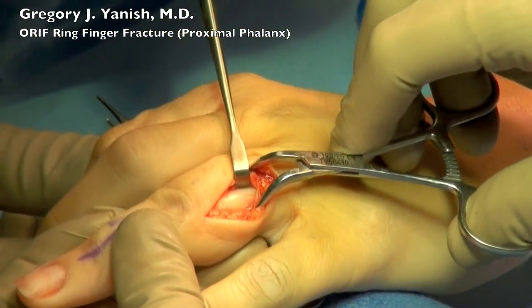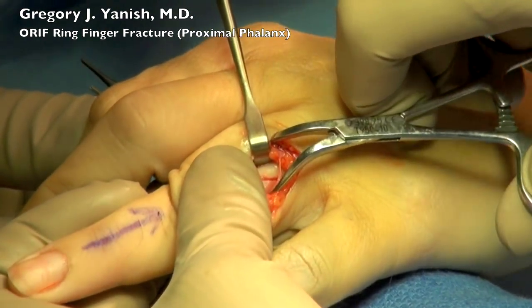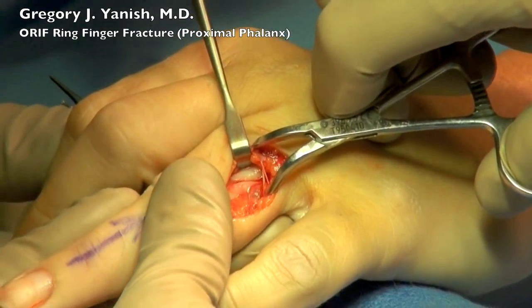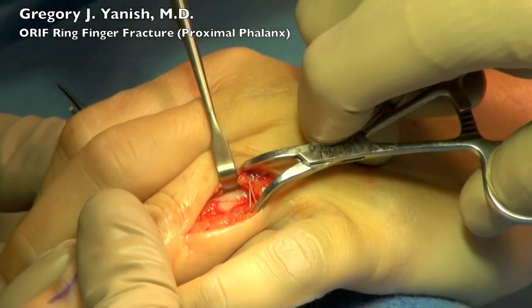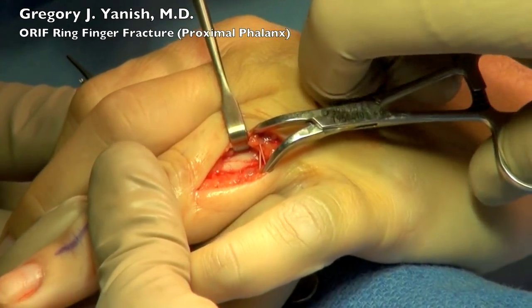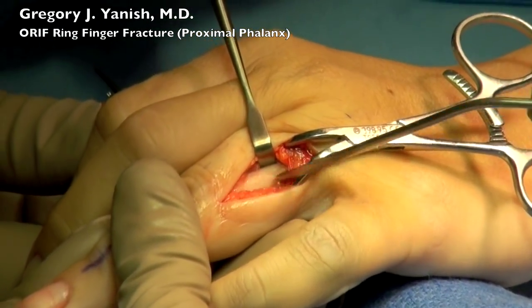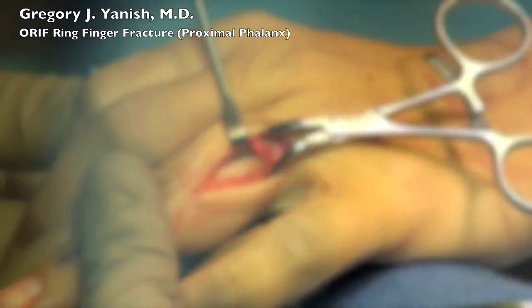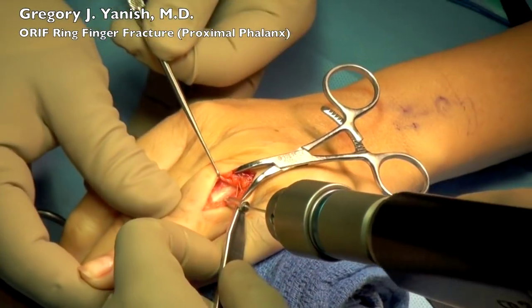I'm now going to be placing some fracture reduction forceps across the fracture site. This is a clamp that essentially just holds the fracture together like a little miniature vise. I'm trying to position the fracture line right now and as soon as I get it lined up I'll squeeze down on the clamp and that holds the fracture steady. This can sometimes be fairly tricky — you can't squeeze specific anatomical structures and the fracture clamp has to be out of the way of where you're going to be drilling and working.